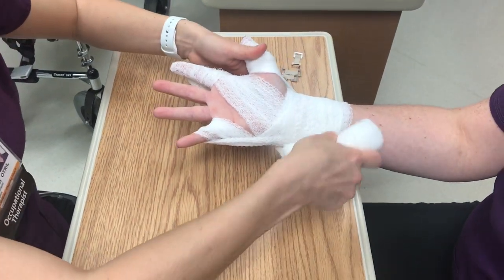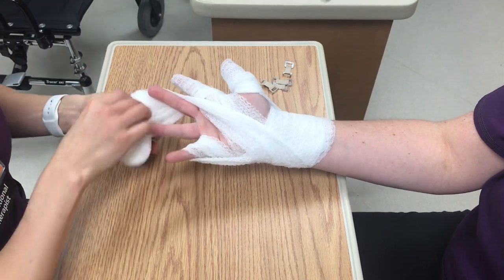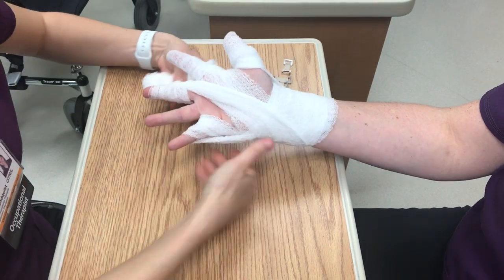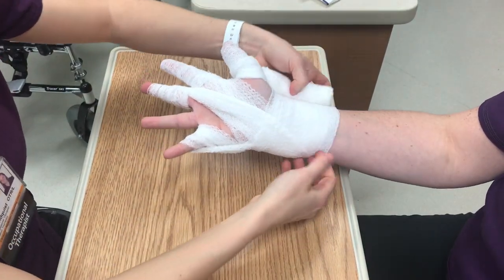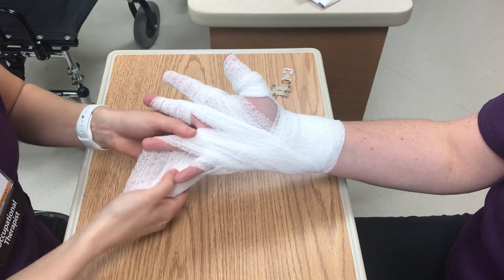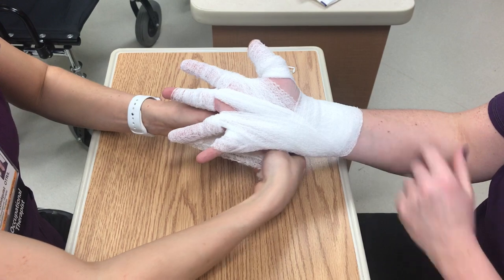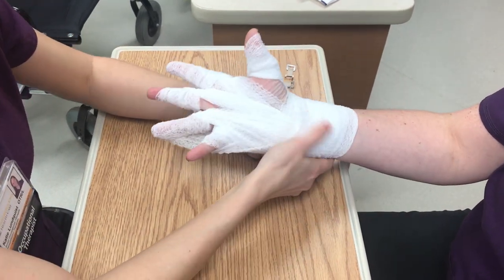Do you feel that? Mm-hmm. Yes. And what's important, too, is wrapping the fingers individually, so it still allows for range of motion as well.